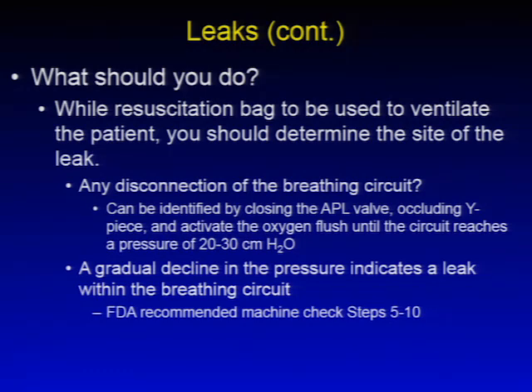Well, you have to find the reason. What you have to do first is to apply the resuscitation bag and continue the ventilation of the patient. While you are doing that, you should determine the site of the leak.